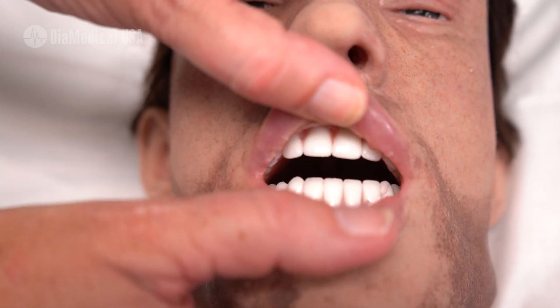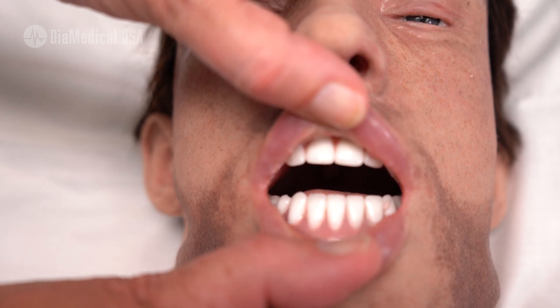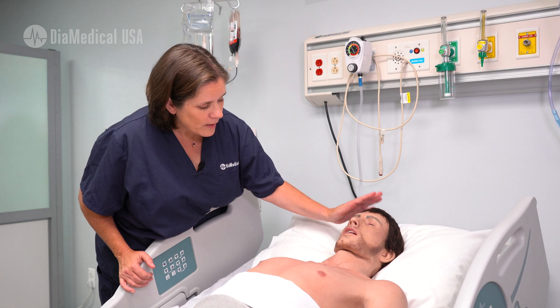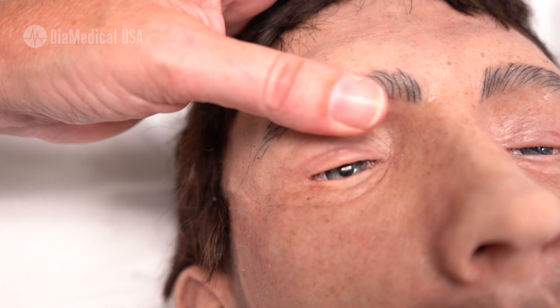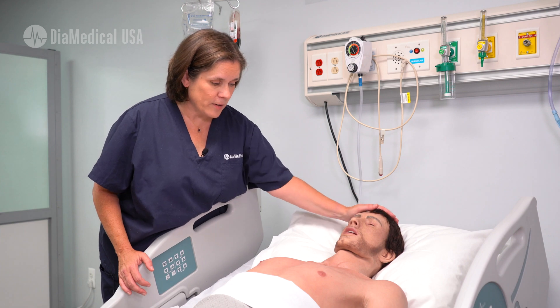His teeth are made from the same material as actual human dentures, so they will chip if students are a little too aggressive when they're intubating. His eyes are about halfway open, halfway closed for theatrical purposes, but students can lift up the lids to check for his pupils, and his irises are very realistic.